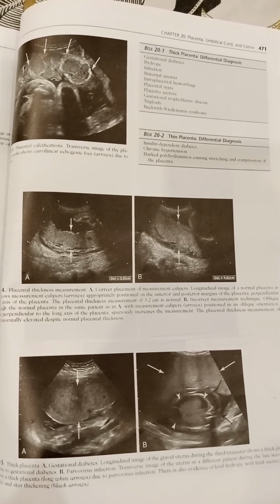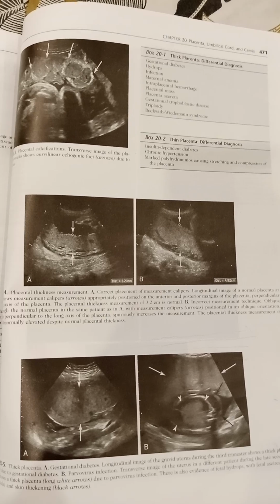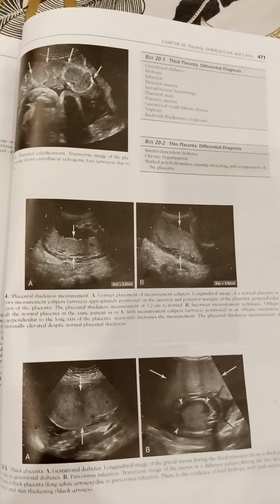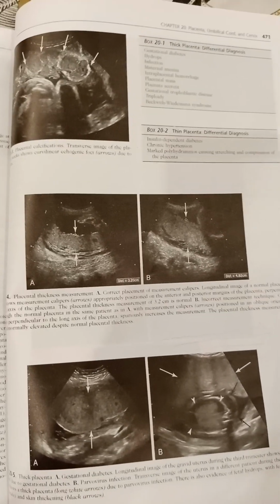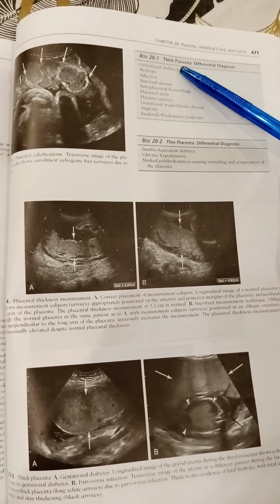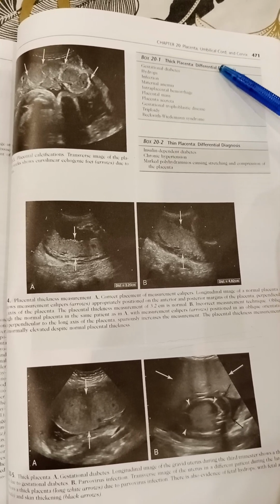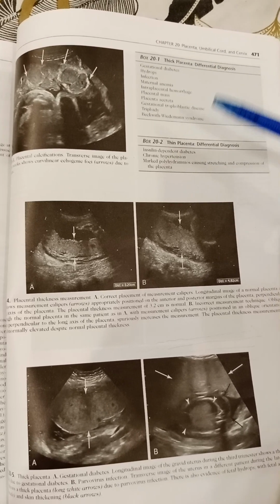Hey guys, so in today's video, I'm back with placenta's sonographic features from the book Requisites in Ultrasound. So first I'll talk about the thickness of placenta. The normal thickness of placenta is between 2 to 4 centimeters. If the placenta is thick, it is greater than 4 centimeters, and if it's thin, it's less than 2 centimeters.